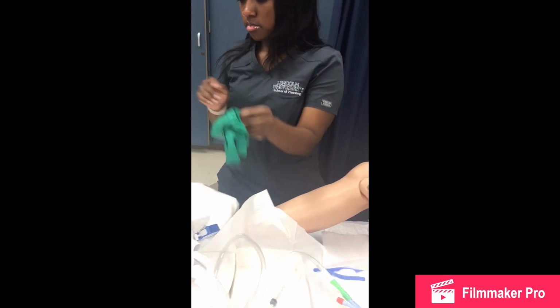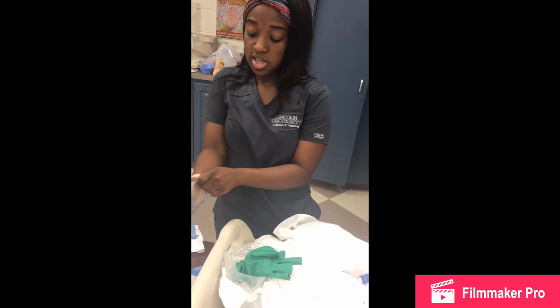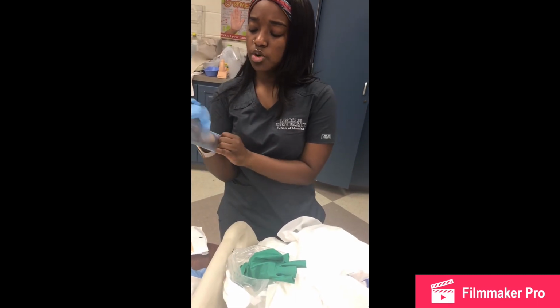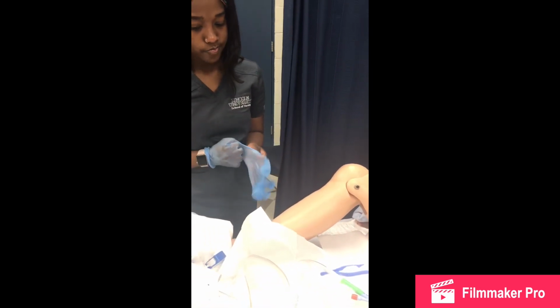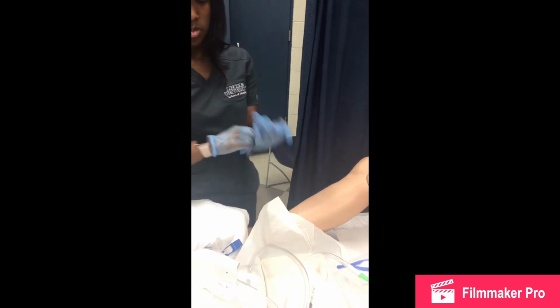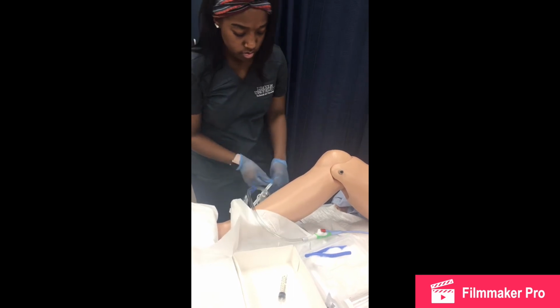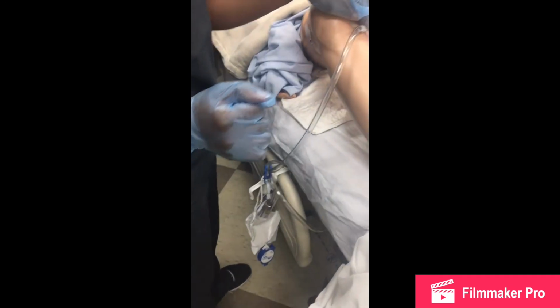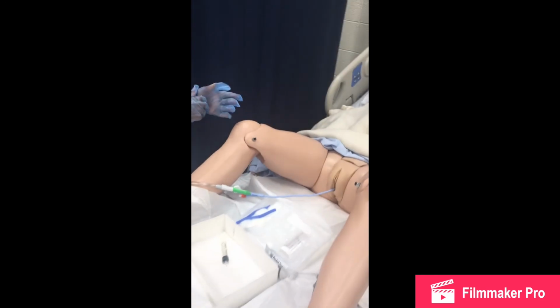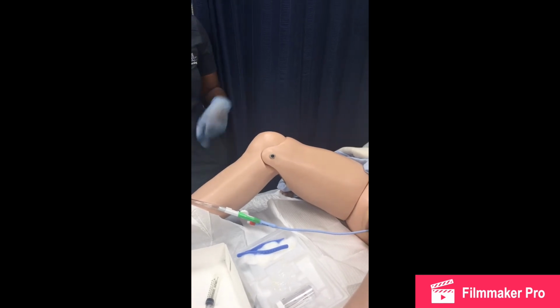I can wash my hands again, and then I can put on new gloves to hook the catheter to her legs, but in this case we're not. We're just going to take the catheter bag and place it on the side bed railing. Now at this point I would document that the urine is flowing out. I would document how many milliliters I put into the Foley catheter, what time I did, what color of the urine, and that's it. Thank you.